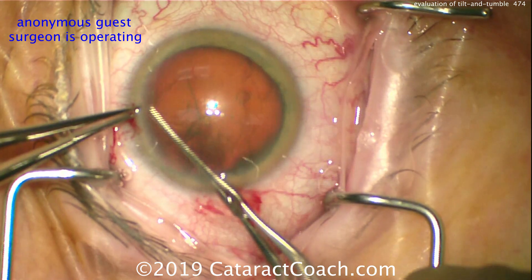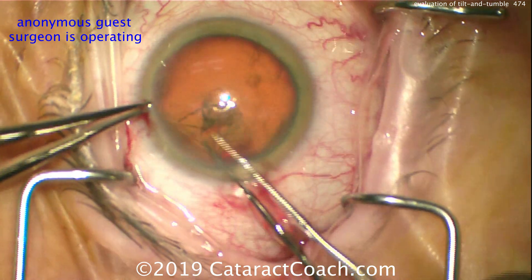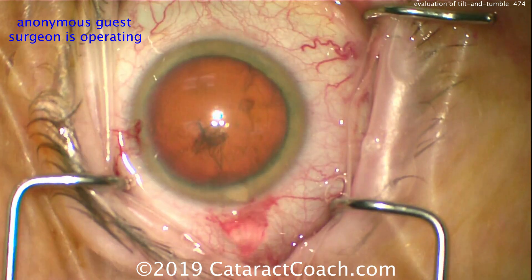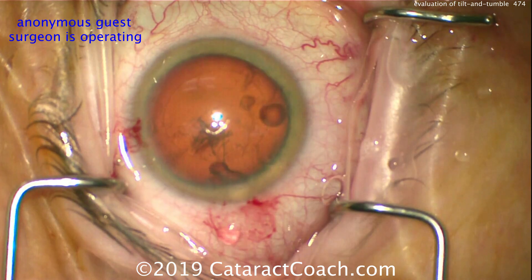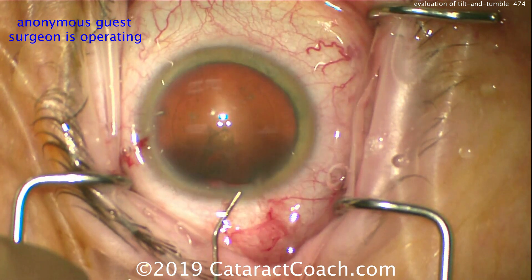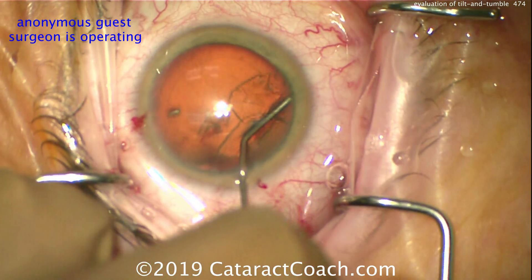Now it's time for a capsulorexis. Again, that looks pretty good. Nice round and generous capsulorexis, aiming for about five to five and a half millimeters — now it's just about perfect. Remember, for this technique of tilt and tumble, or bringing the nucleus halfway out of the capsular bag, we do want to have a sufficiently large capsulorexis.